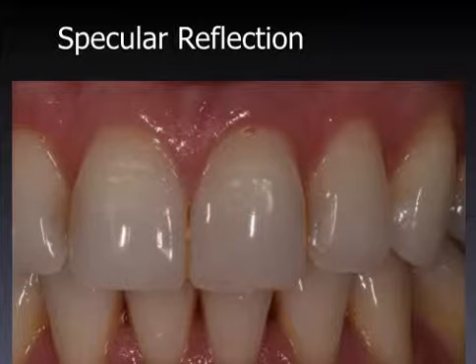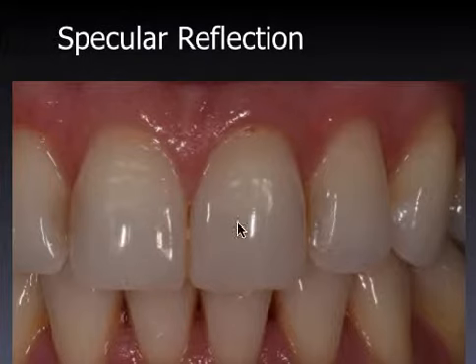Another problem for restorative guys is this specular reflection, these shiny bits. This patient has very smooth teeth through erosion, but younger patients with their tertiary anatomy of the enamel we can't see. So how can we avoid this? We've already mentioned polarization.